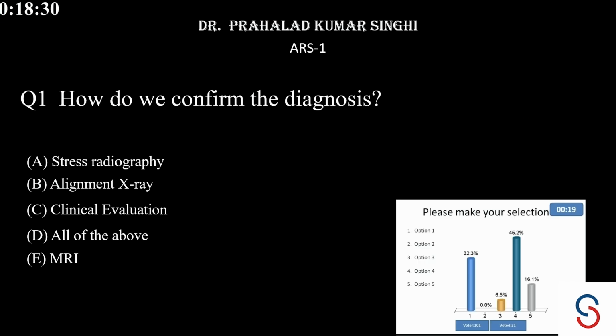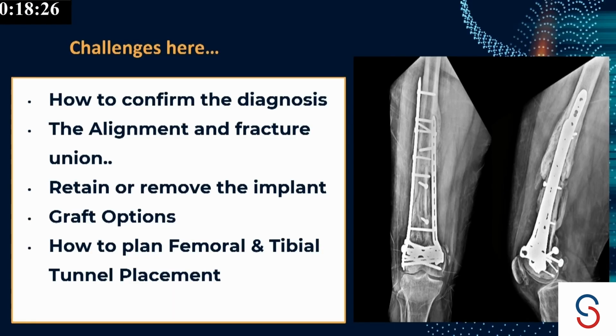I think it was very pretty simple. We have to rely on all these parameters. We need to take a stress X-ray here. We need to rely on our clinical examination. MRI is a little challenging here because of so much implant.